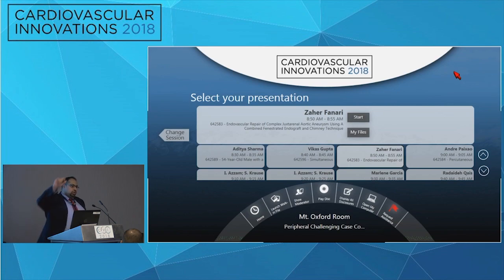We knew the right renal was fine, so at least we have one renal artery protected. But the main problem was the SMA. We were very clear with the patient that the mortality risk in this procedure is very high, but it is higher if we don't do anything. I think that discussion is a crucial part of your documentation. If we learn anything from TAVR meetings and structural heart, as we're dealing with these very old patients, it's justifying why you're doing these procedures and looking at frailty. These things are translational.